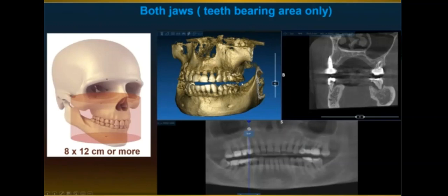Something very important here, it's very important that during scanning of the patient for implant cases is to try to make the teeth separated from each other, not to be closing occlusion, because when two metals are occluding together, they intensify the effect of each other.